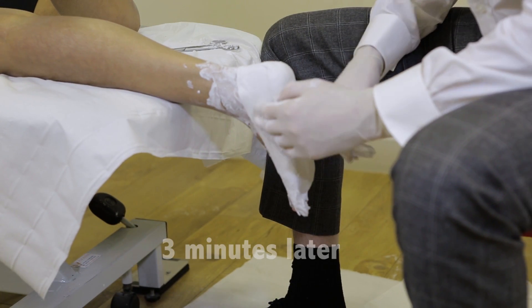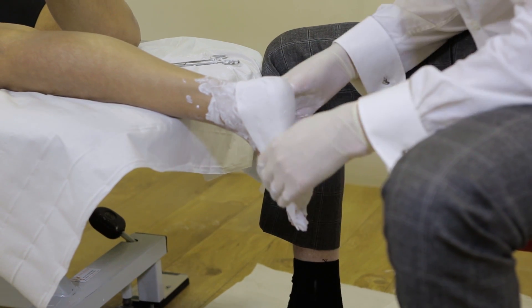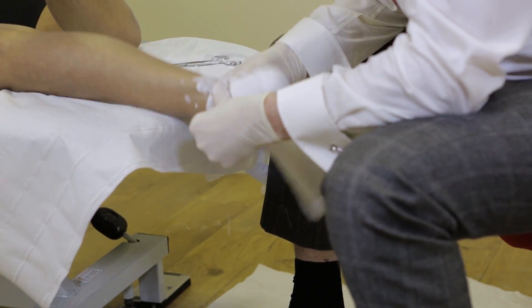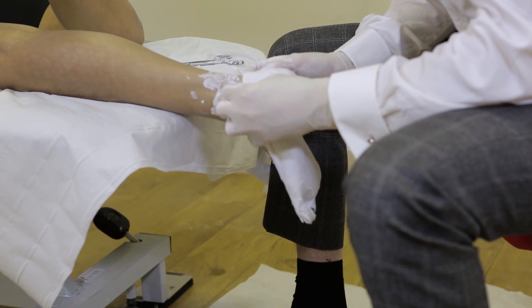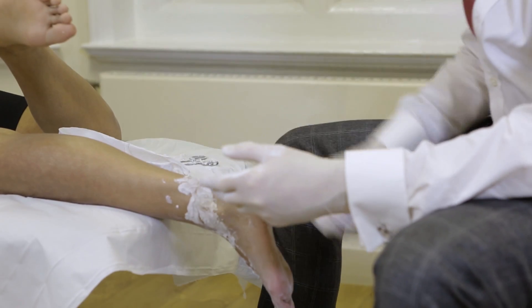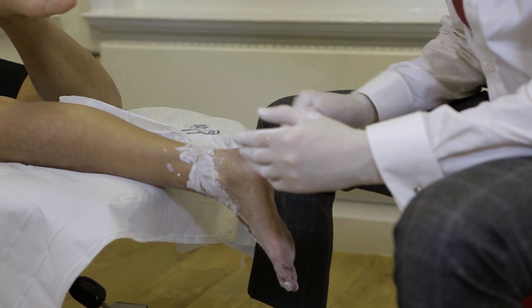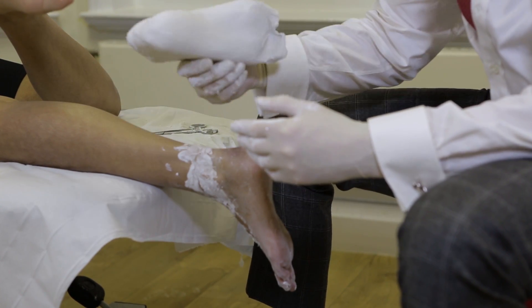So now we've got the cast set nicely — it's nice and firm. What I'm going to do is give Neely's foot a little shake, and then I can just gently tease the plaster cast off. And that's sitting nice and flat on the work surface. So I've corrected the forefoot position nicely, and we're ready to go.